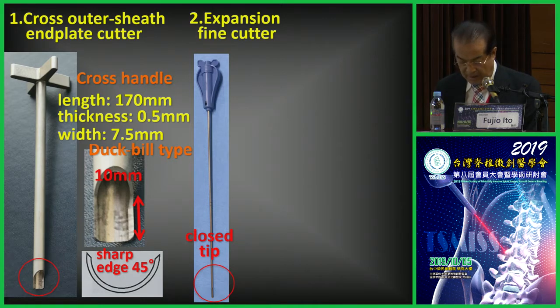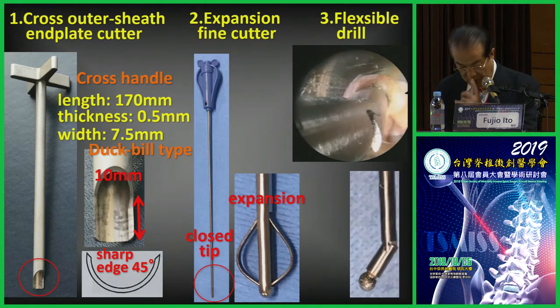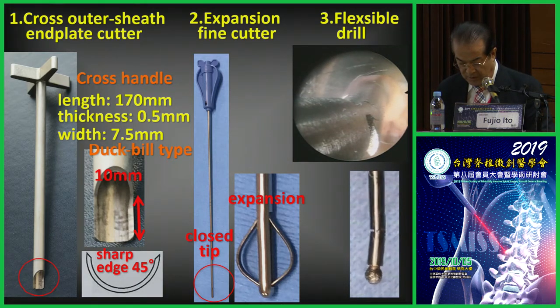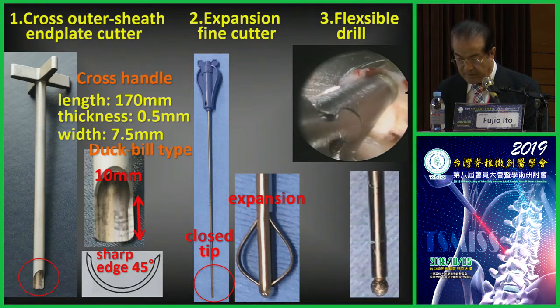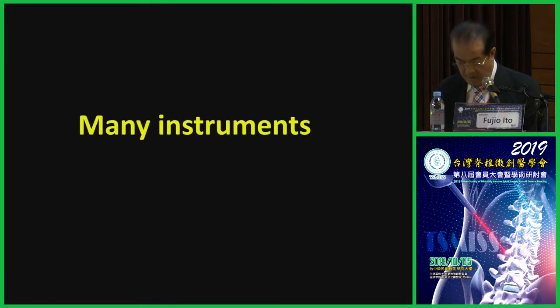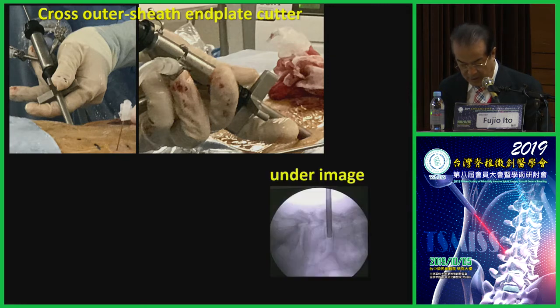First, it is inserted with the tip closed and is expanded in the disc space to dissect the irregularities. The flexible diamond burr is useful to drill the end plate under endoscopic view. Among many instruments, the cross outer sheath end plate cutter can scrape the end plate as a thin layer while rotating under the endoscope. You can also check under image.